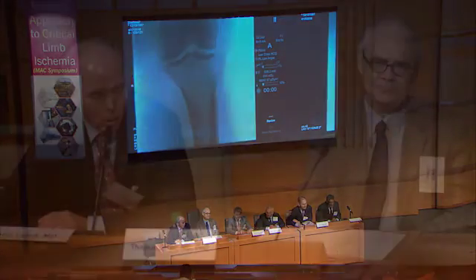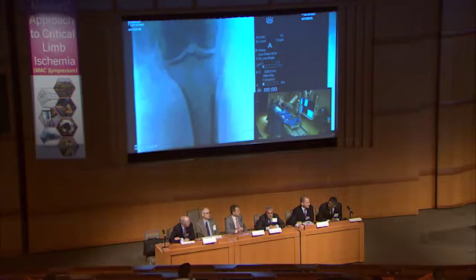No, I think we would balloon the below-knee vessels. We don't really have the option of drug-coated balloons for the infrapopliteal vessels in the U.S. now. And then if I got a good result, I'd probably leave it. If I got a suboptimal result, I would put a coronary DES into the proximal tibial arteries. So you would recommend going for the posterior tibial CTO along with the... I would open everything up. You will open everything up?